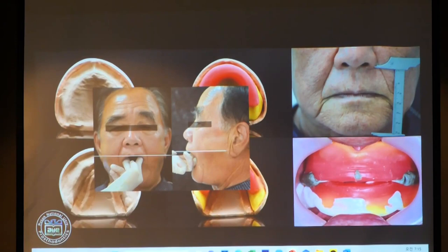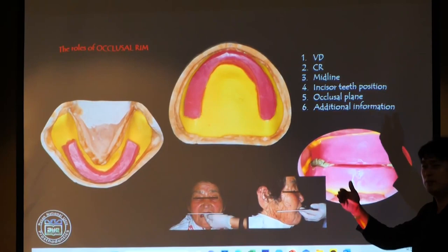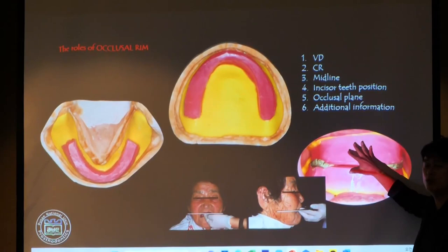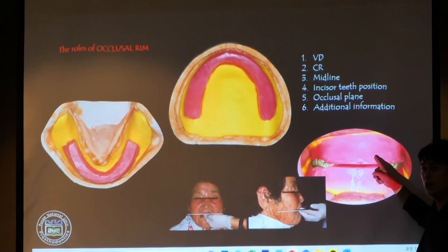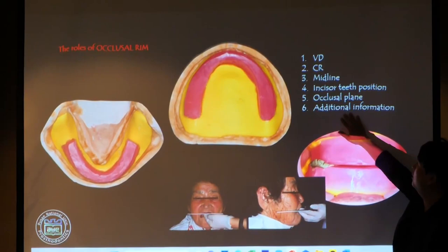Anyway, we have to remember the role of the occlusal wax rim. As I explained in the previous lectures, this occlusal rim has to include a lot of information. This is the sequence to detect the occlusal information. The first one is vertical dimension. Second is centric relation. Third is the midline. And then the location of the anterior teeth. The upper jaw anterior teeth location is very important to determine in these steps. And next, the occlusal plane, and then we can get additional information.